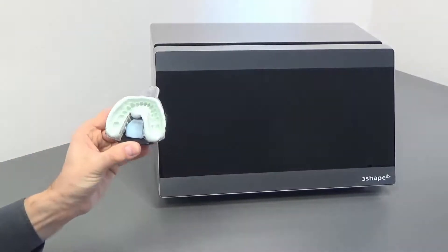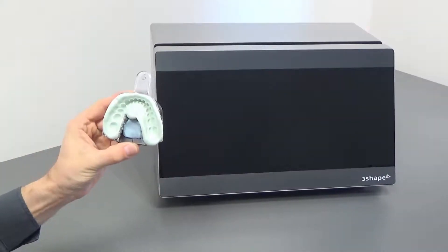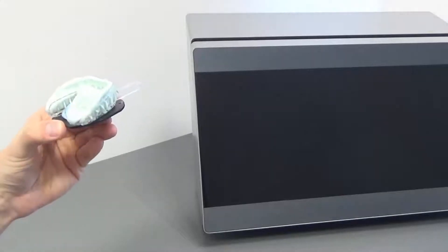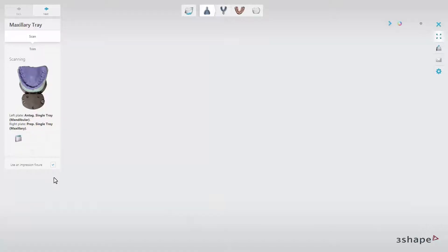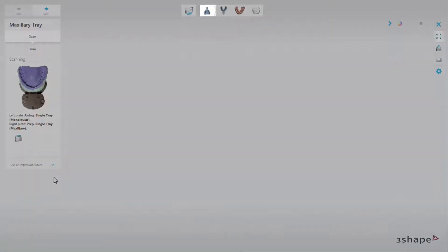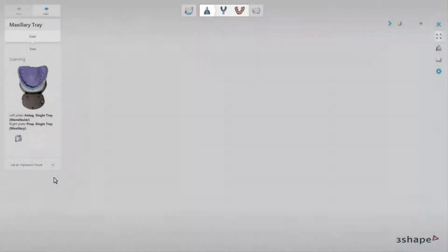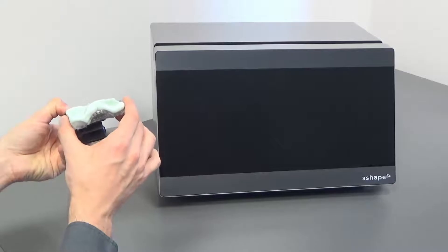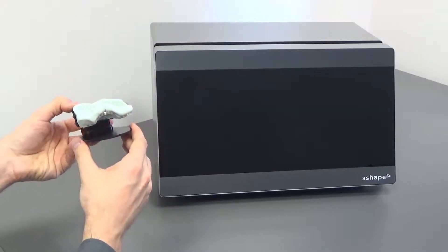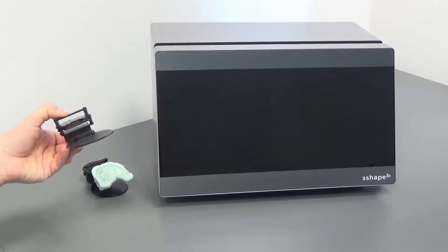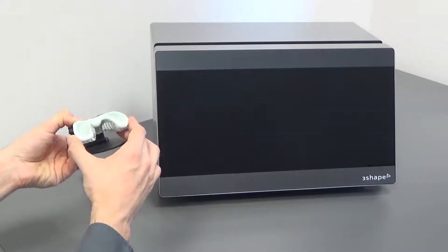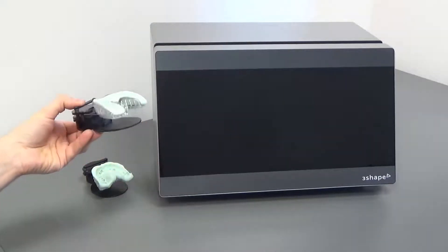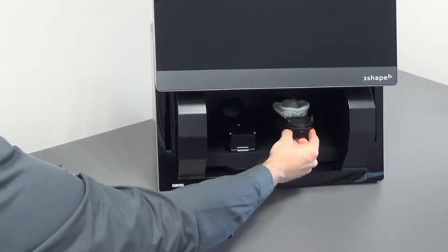Scanning without an impression fixture can be done by using BluTac in the same way you would use it for plaster models. The first step in single tray impression scanning is to scan the upper jaw impression, then the lower jaw, and the bite impression at the end. You can follow these steps or decide on your own scanning order. Always insert the impression in the way shown in the overview window. If you use the D2000, you can insert both impressions at the same time. However, if you use any other scanner, you have to insert impressions one by one.